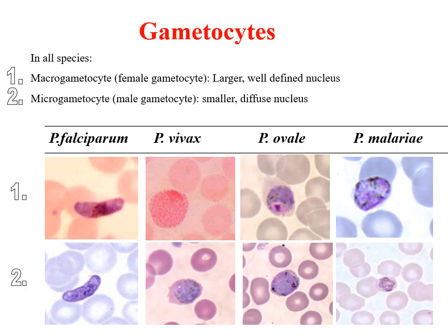Now, to wrap up this section, I want again to remind you that in case of falciparum, what we see are usually either RBCs infected with multiple rings or crescent gametocytes, and this is what concludes the infection with falciparum. For vivax to conclude the infection, we should be able to see enlarged red blood cells and, more importantly, schizonts with 24 merozoites.